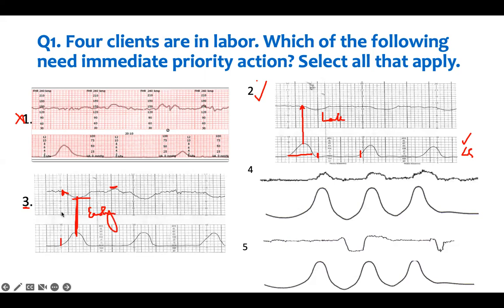So early deceleration is head compression. It's also not good. We got to do something about it. Okay. The baby head is being compressed. We don't like that. But it's better than that. But at least we have to do something about it. It's not the worst of it all. Mostly some people will say early deceleration is okay, we don't need anything, but just know that you're having head compression of the baby. So there's no actual emergency. This is more emergent than that.